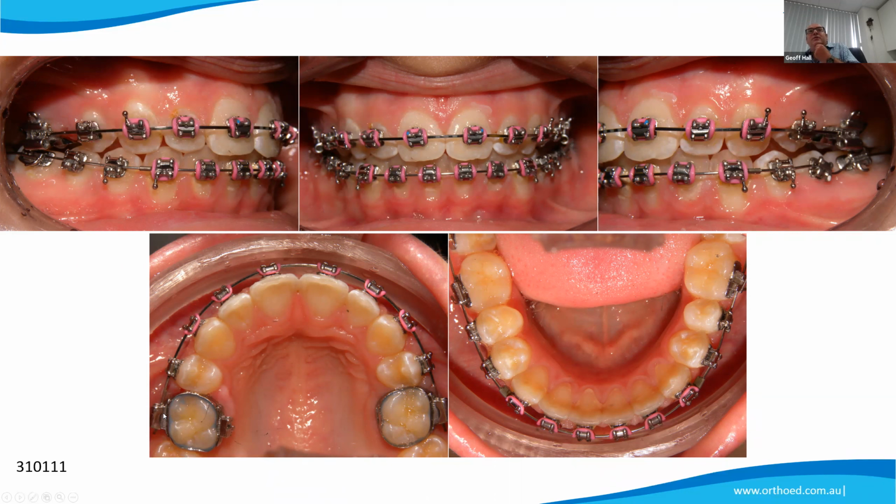So, Jim, do you remember in your POS, you would have had a prescription for a molar for a class 2? And it would have had distal or something, wasn't it? Yeah, and that's the reason. So this molar is not too bad. This molar needs to rotate more mesial to the palatal. Would you do that, if you did want to correct that, by banding up the 7 and connecting that?